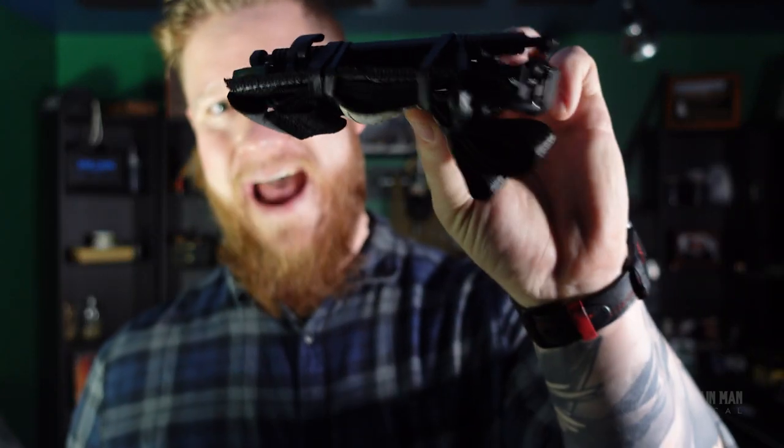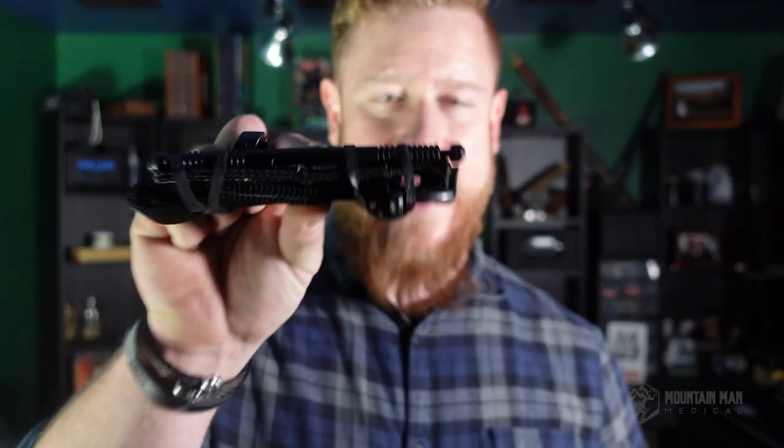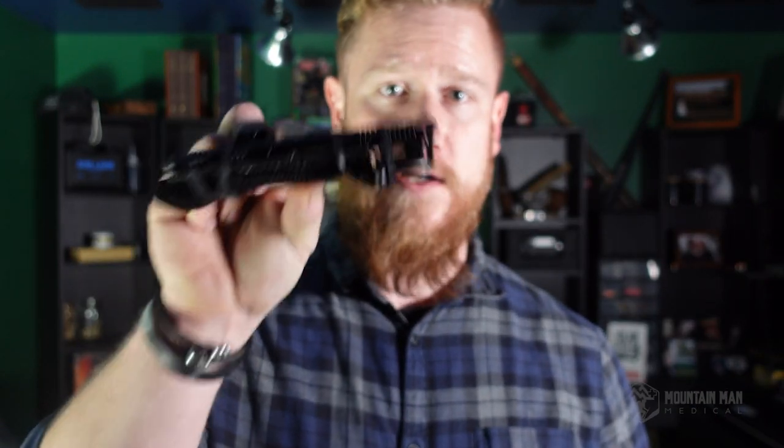Welcome back to the Mountain Man Medical YouTube channel. Thanks for hanging out. Today we're going to talk about how to flat fold the new generation SOF-T Wide — how to go from this travesty of a tourniquet, just a mess, to a nice clean little package like this. This is the flat fold of the new generation SOF-T Wide.